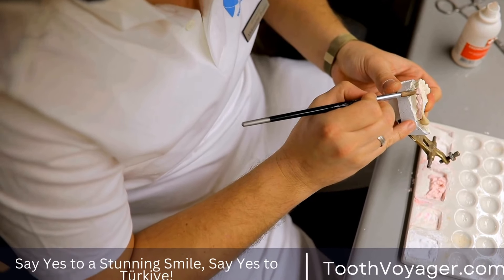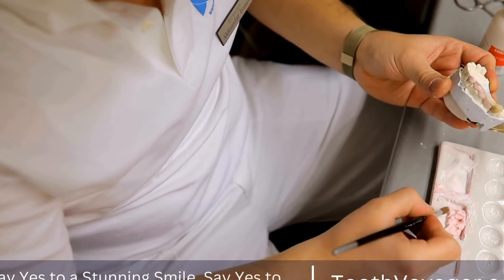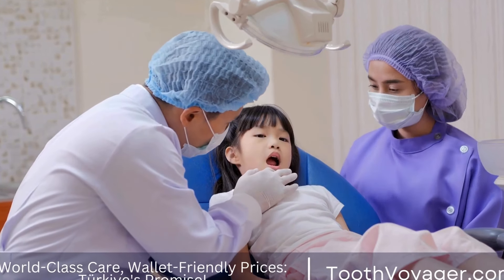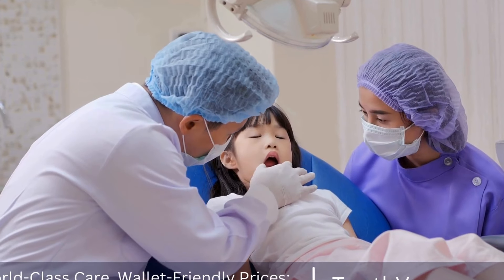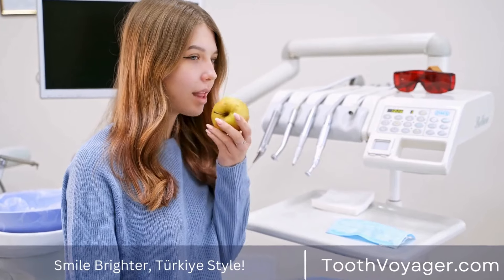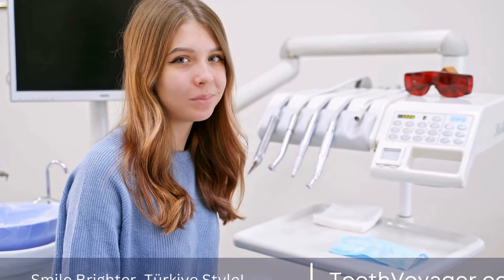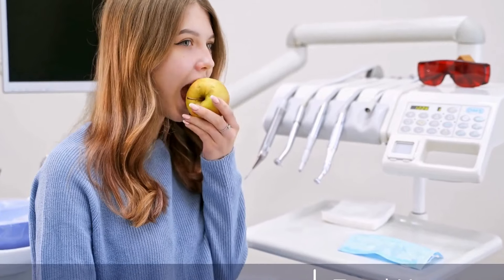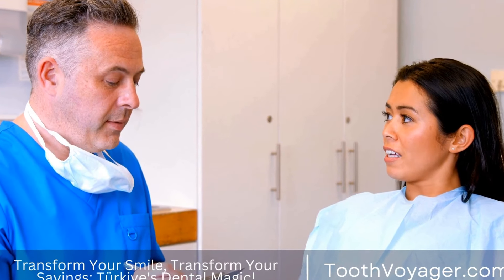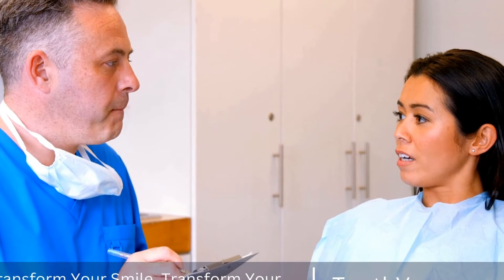Root canal therapy can be a very effective method for saving a tooth which has decay or infection. By following these steps, the dentist will be able to eliminate the infection, protect the tooth's natural structure, and avoid the necessity of extracting the tooth. If you're experiencing dental pain or other signs that could indicate the need for root canal treatment, don't hesitate to call your dentist for an assessment. The root canal procedure can aid in maintaining a well-maintained smile and help avoid expensive dental treatments in the future.